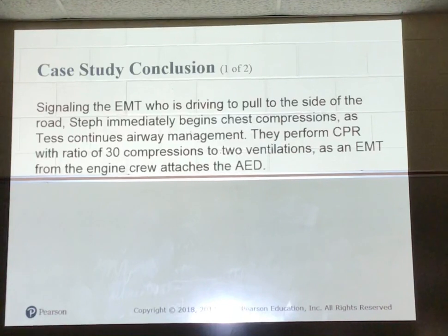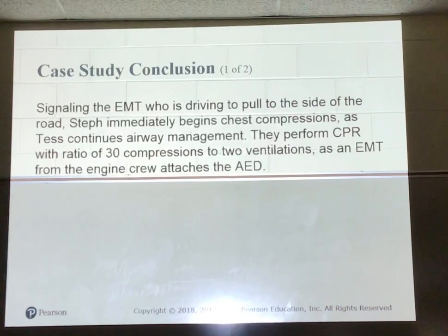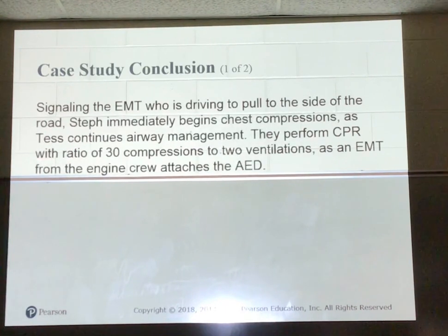So if I have a pacemaker, where do I place the pads? Beside it. So you just put it off to the side, away from the pacemaker, or you have to put it on the opposite side of it? Don't put it on the opposite side. The electricity through your heart goes from the top to the bottom. Don't put something on this side over here. Put it over on the other side, or this side, or on top of it, or below it. Don't go to the other side. Basically feel where the pacemaker ends and then move the pad to the edge.